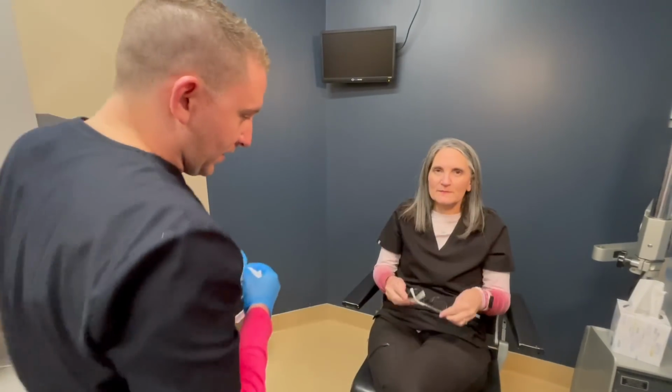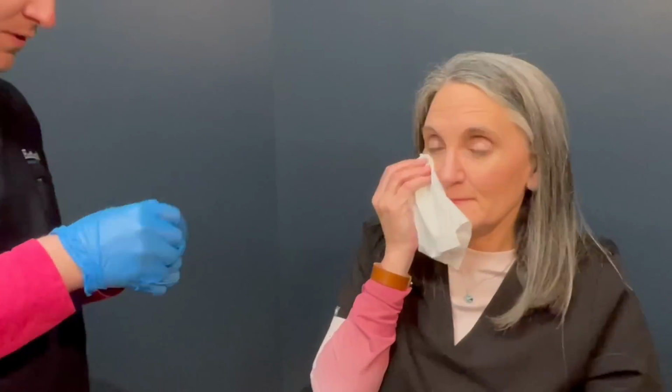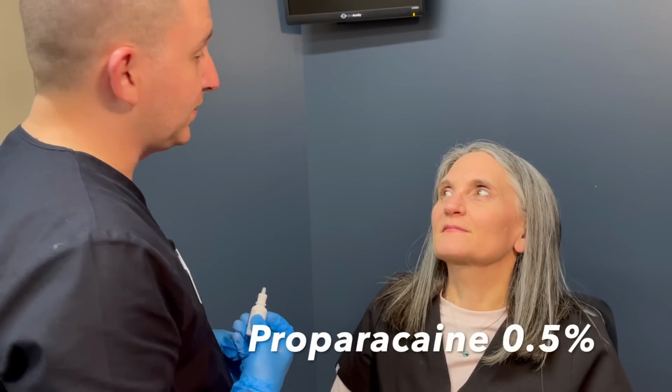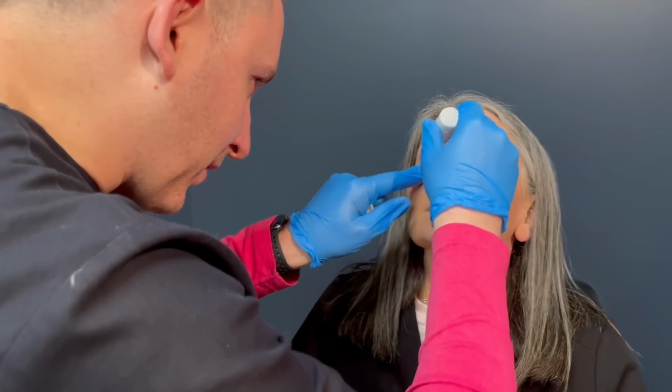First thing we're going to do is get these little instrument devices out and prepared. But first things first, we're going to need to make sure that Heather's got her glasses off, tissue for when we put the numbing drops in, because we like to numb the patients up for just comfort measures at this point. So it's just a little Proparacaine 0.5%. And all I need you to do is lean your head back for me, look up to the ceiling as high as you can go. Just keep looking up right there for me. Good. You can blink a couple of times and catch the little drops that run down your cheeks.